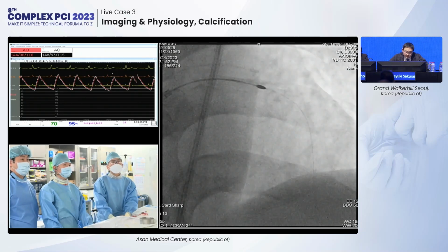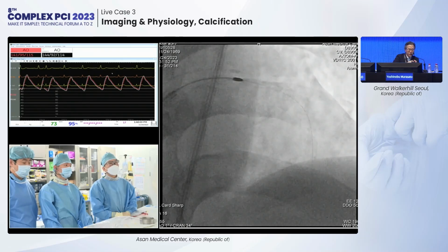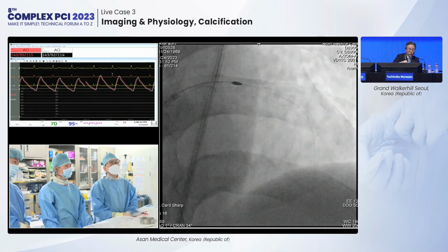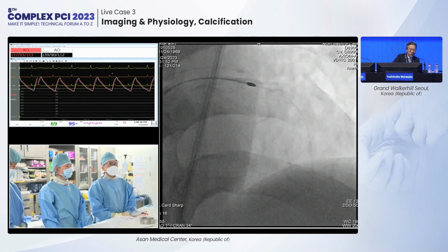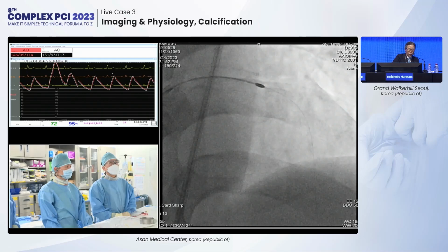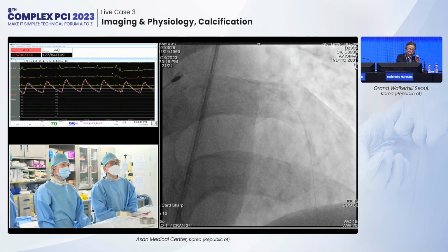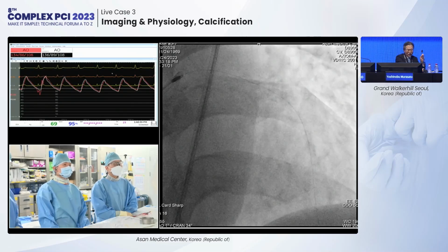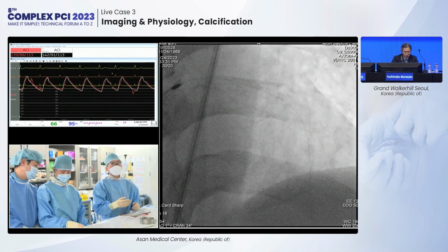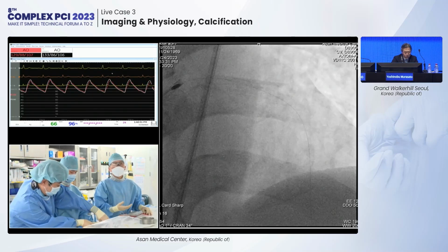Maybe you feel some difficulty advancing devices because the guidewire pathway is inside the plug, another lumen or microchannel. That is why you cannot pass easily. So with a bigger balloon, 2.5 or something, you can pass through easily. The calcification is deep, so I don't think rotablation is effective for this problem on the CTO side. Yeah, then I will follow your opinion. Because with the 1.5 burr, as you feel, the debulking is not enough, I think. But after removing the rotor, I will check the IVUS, whether there is some change or not. Okay.